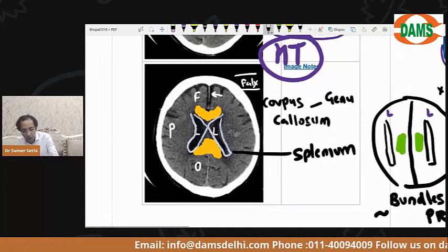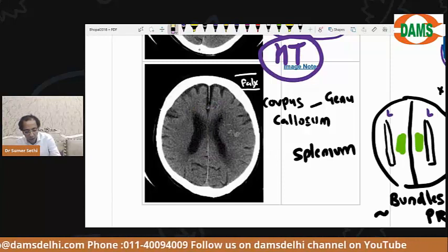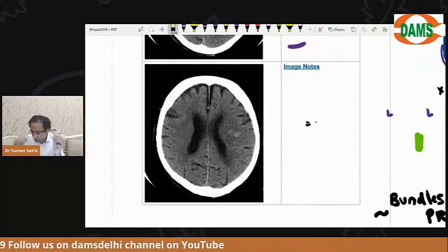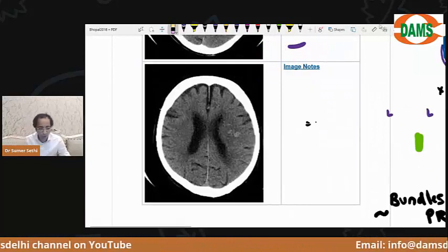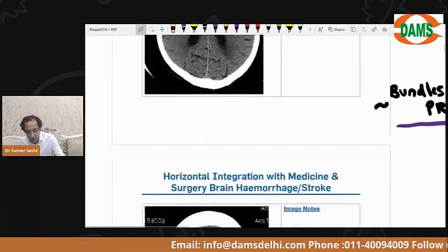So we announced the schedule, I think, multiple times. Even I had shared everywhere, and I think your coordinators, everybody had shared multiple times. Huh? Now, are you clear with this or not? So this is how I have given you an overview of how the brain looks like and how to look at the CT of the brain.